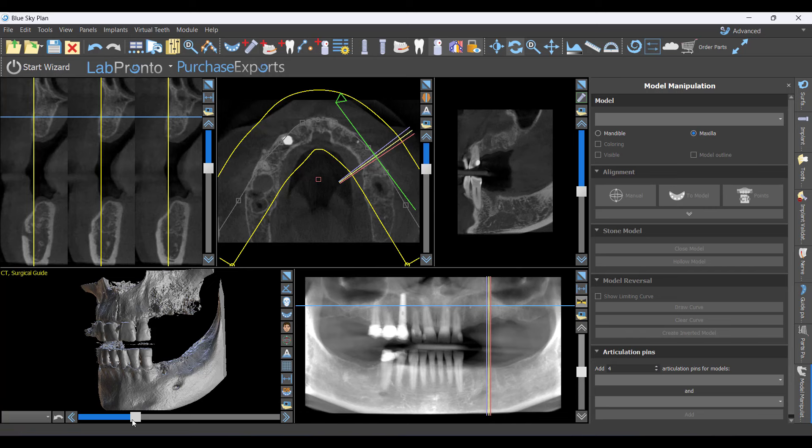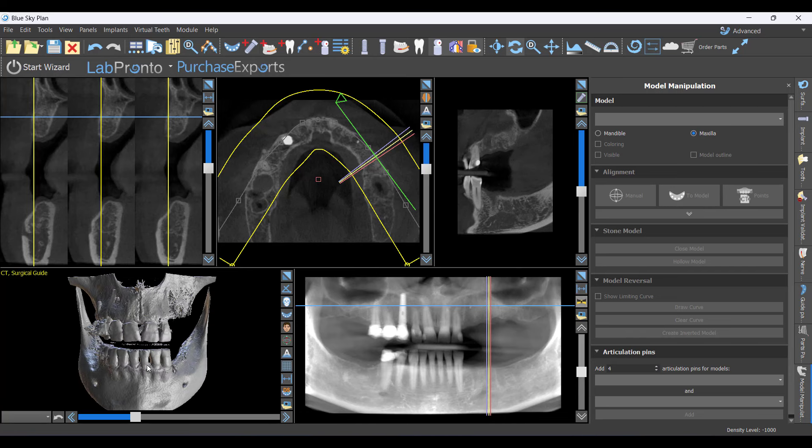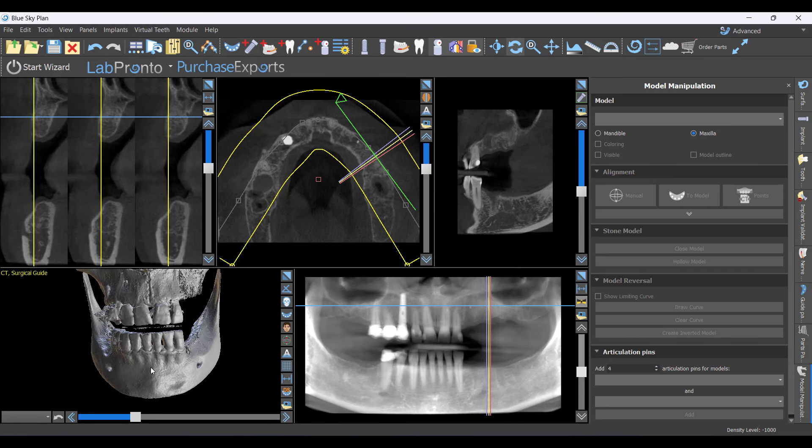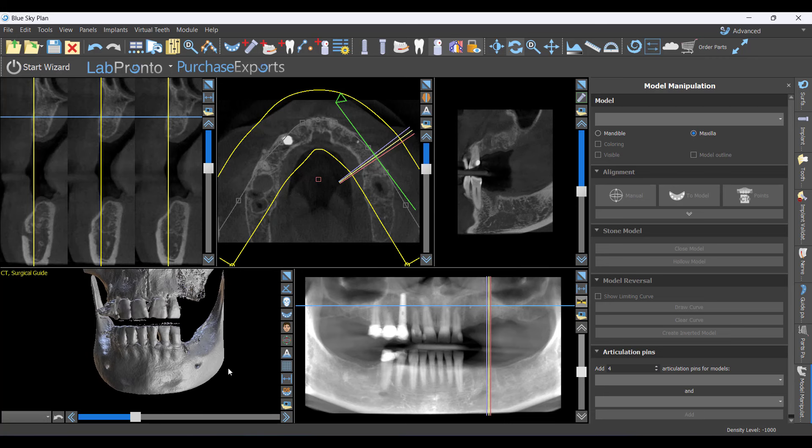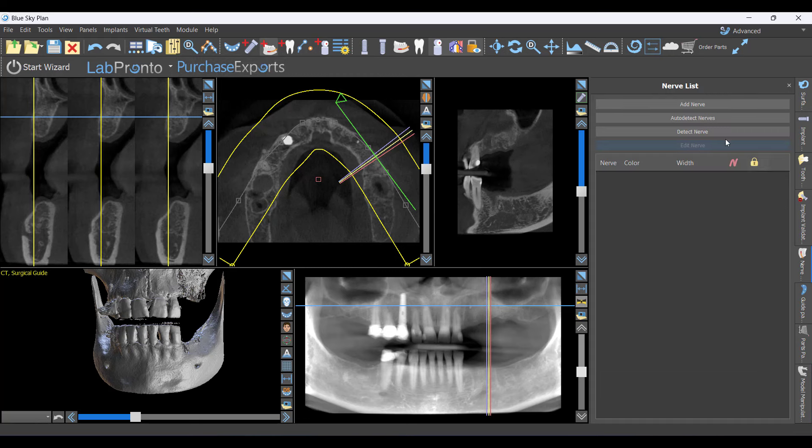All I've done so far is open the case in Blue Sky Plan — nothing else. You can go in different orders; I'm working in advanced mode. The first thing I'm going to do is map the nerves. Going up to 'Add Nerve,' you can do it manually or detect individual nerves, but the simplest way is just to say 'Auto Detect Nerves.'